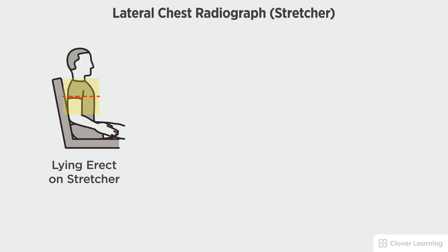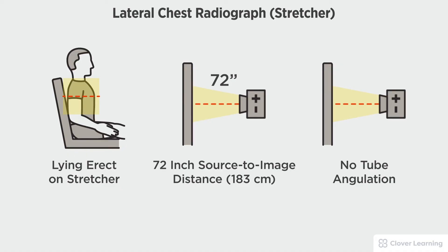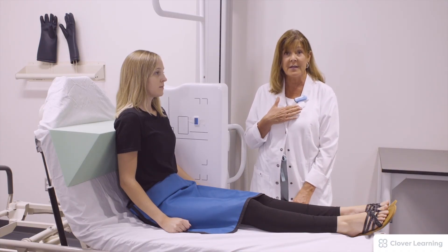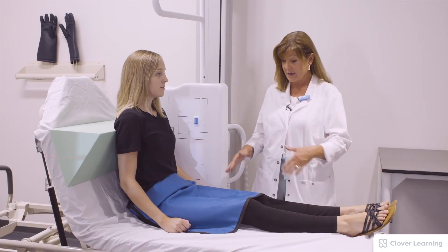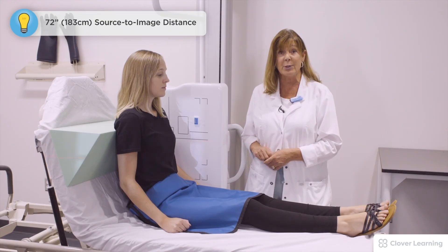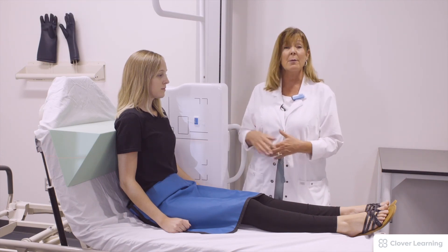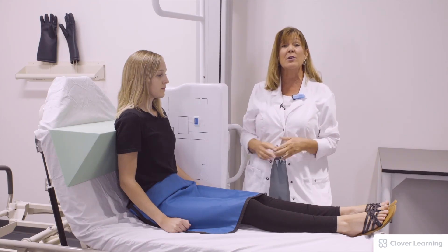In this view we will be demonstrating a lateral chest with a patient lying on a stretcher. The head of the stretcher should be adjusted to place the patient's chest as erect as possible, with a 72-inch source to image distance and no tube angulation. Our patient is unable to stand. We're going to do a left lateral chest because the heart dips a little more to the left. We've placed our patient as close as possible to the IR. I've made sure the stretcher is locked, placed a lead shield on the patient, and set the x-ray tube perpendicular at 72 inches. I've also placed a sponge behind her back to help her stay forward.